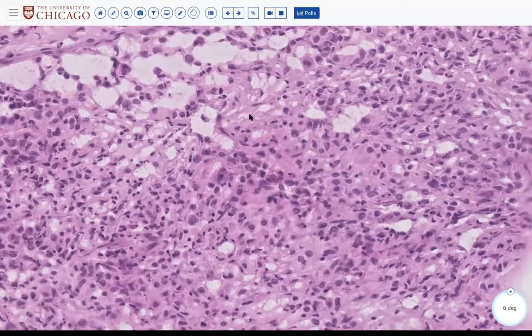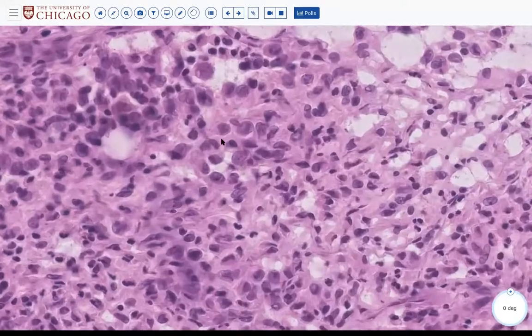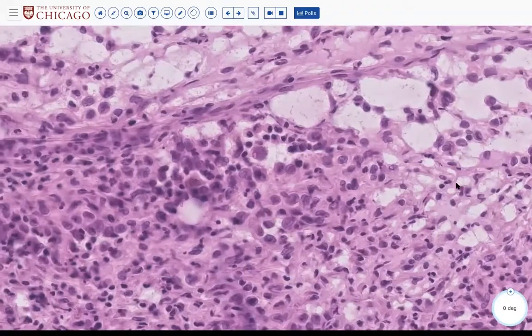So Perry, what made you think about histiocytoid? I thought I saw maybe some grooving in some of the nuclei, and I saw maybe a couple of EOs floating around, although I might have been totally hallucinating those. It was late last night. I don't see them now, so I think I was probably imagining them.